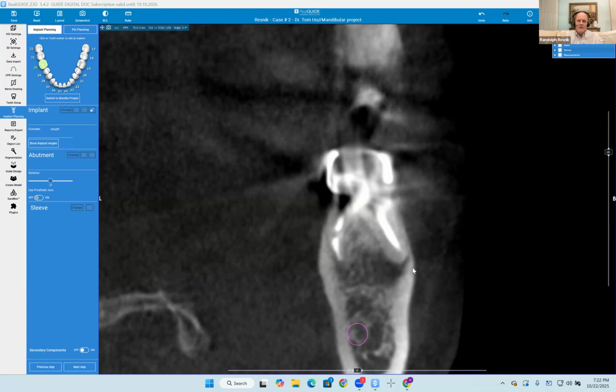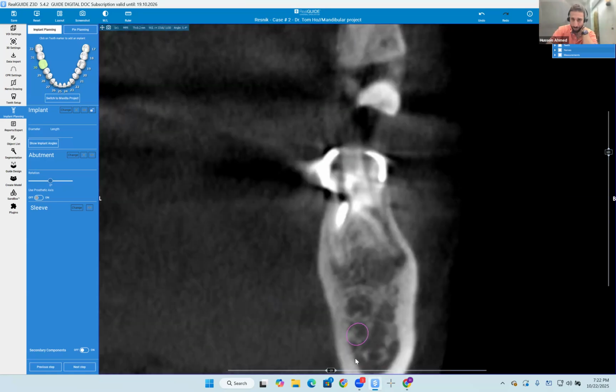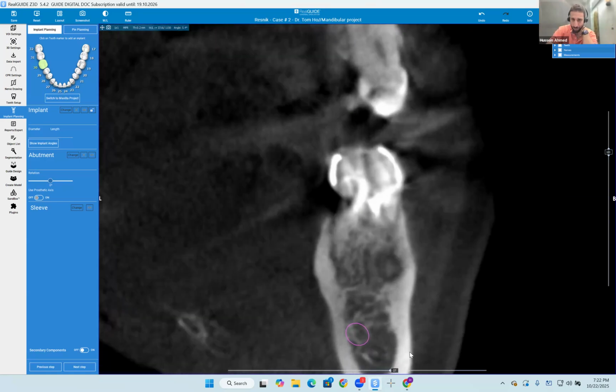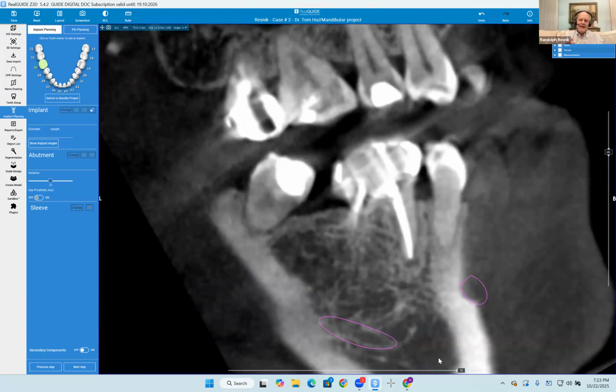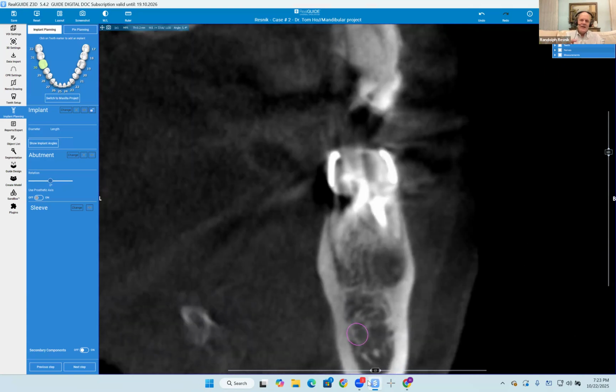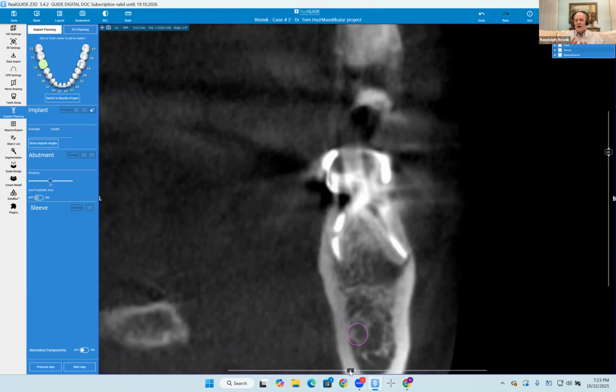So, Doc, what I would do is do a 360 on this. You got it, Professor. It doesn't perforate the plate. Doc, I would get that out of there. The reason is that it is probably expanding. As it's expanding, it is compromising that bone.